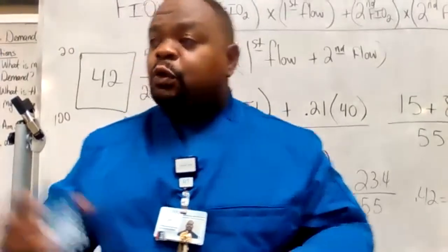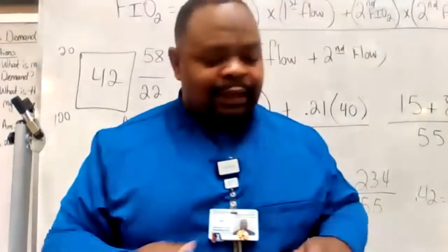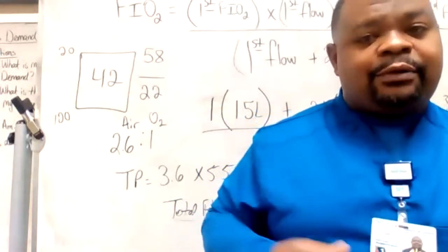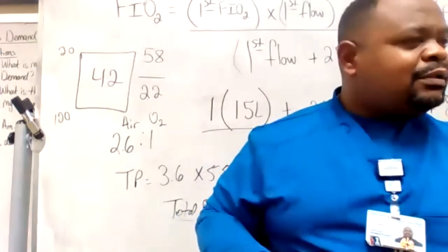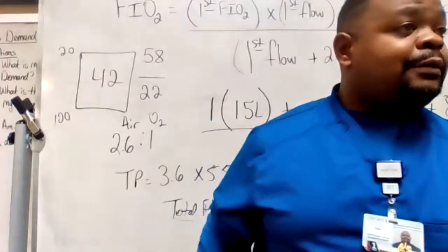You won't have to do all of this in the hospital. It's not going to be on the test. You won't have to tell me the FiO2, this flow, and that flow. But that's something you should be able to do and feel good that you can do.